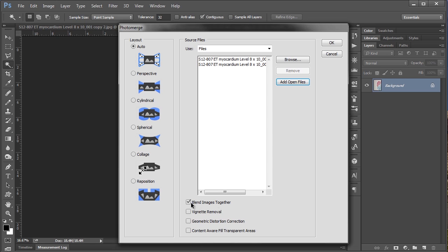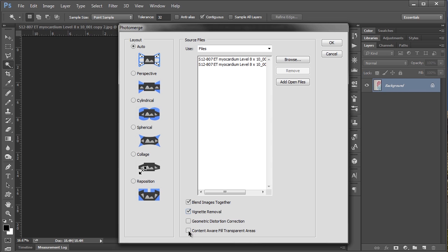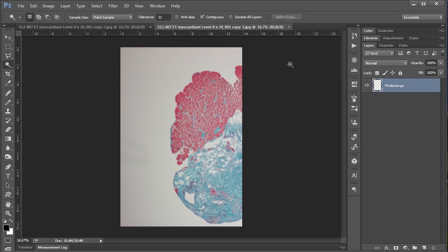And I know CS3 has blend images together which I'll usually check. Because that's going to correct any sort of lighting inconsistencies within your images. For the time being I'm also going to check vignette removal because that can sometimes be an issue with microscopy images. And I'm also going to say content aware fill transparent areas because I know for a fact in this image there is a transparent area that we might as well fill. And with that I'm going to say OK.